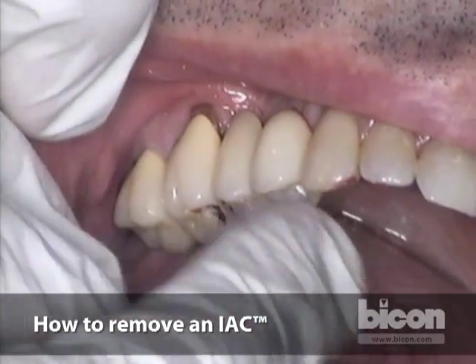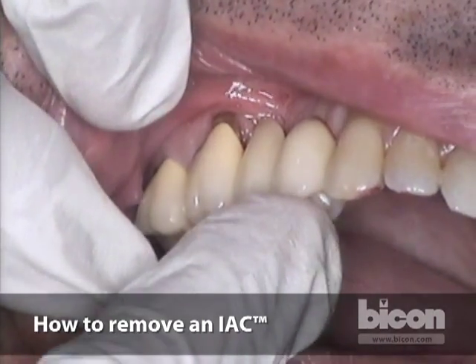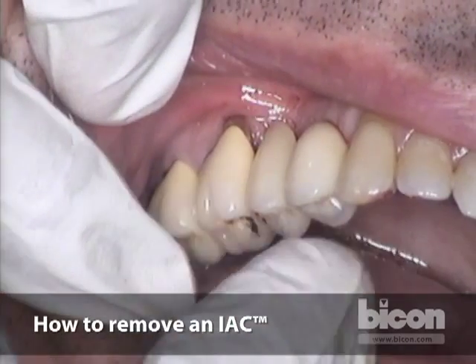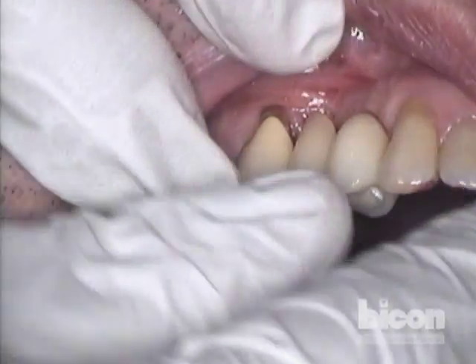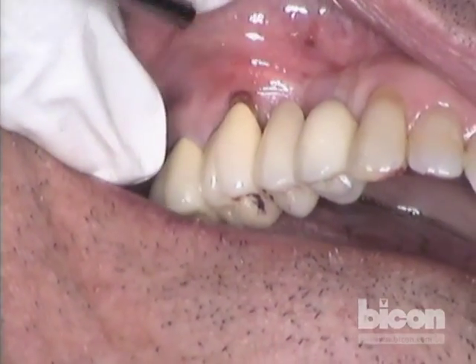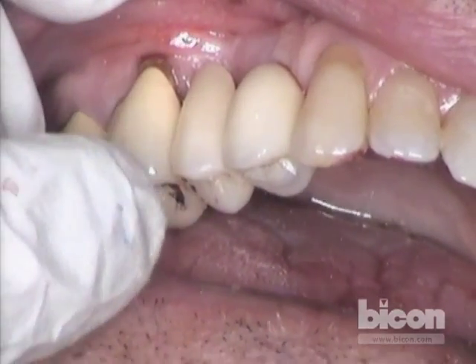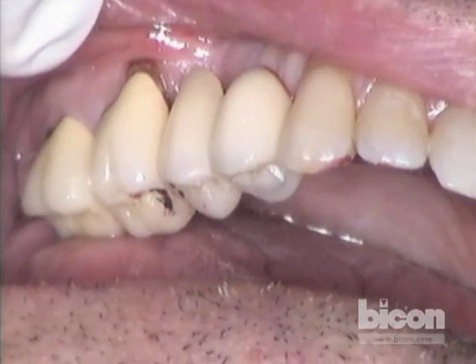One of my most favorite features of this is the ability to remove the crown if needed in the future — for adding contacts because it broke, or whatever necessary adjustment. As you can see, there isn't any metal showing, but if there was any metal showing in the abutment, I could remove the crown and send it back to the lab to add a little bit more composite in that metal area and have it repaired, so there's no need for any problems.